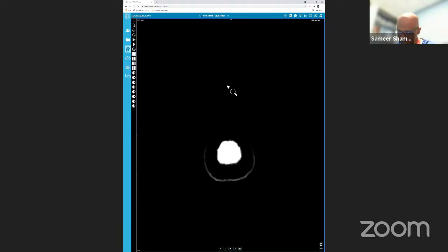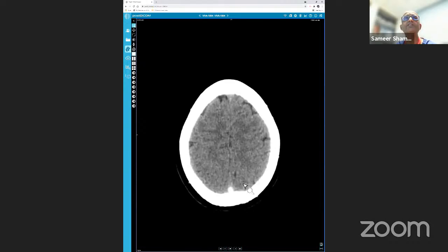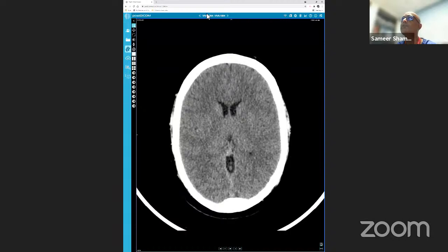Case 04 was venous sinus thrombosis. Again, very well done. You picked up the cord sign and then you looked for venous hemorrhage. So in the exam, you can say that I would normally look for venous hemorrhage in the parasagittal region, along the superior sagittal sinus. It will be in this mid-band where you actually get the hemorrhage. And the rest of the scan looked absolutely normal.